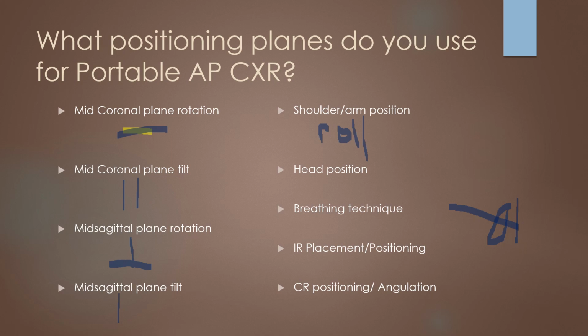If you over angle, we'll see what happens. If you under angle, it's a different problem. So we just want to make sure that we're trying to learn to get the perfect angle, and that is going to be some trial and error for sure.